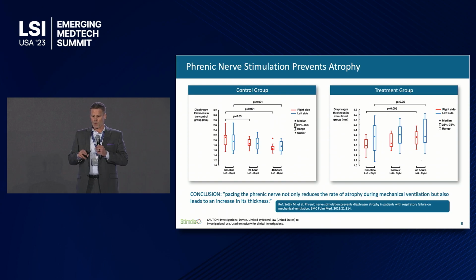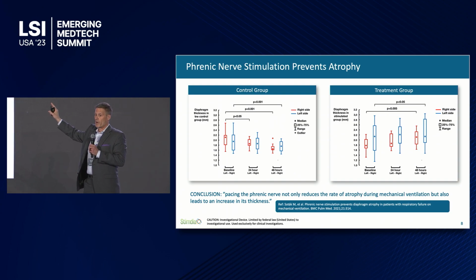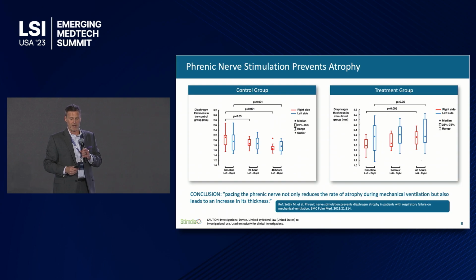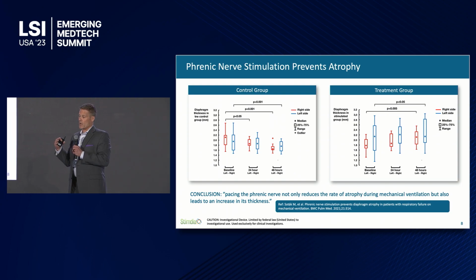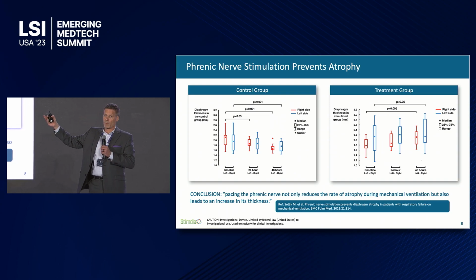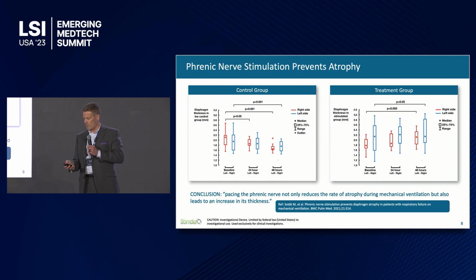One of the physicians that was involved on that trial took the cohort. So if you take a look at our treatment group, it was non-randomized. The one on the right-hand side for you here is the cohort that we had in the clinical study. The one on the left-hand side was a control group that he enrolled after our study was complete and did the same protocol on those patients. They had similar demographics to our treated group. And as you can see here, there's a trend in the negative direction in the control group, and on the treatment group, the trend is in the positive direction. That's consistent with the data from the previous slide that would suggest that these diaphragms are getting thinner over time, losing some of their strength.